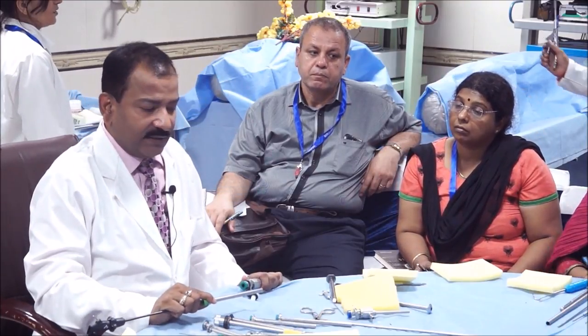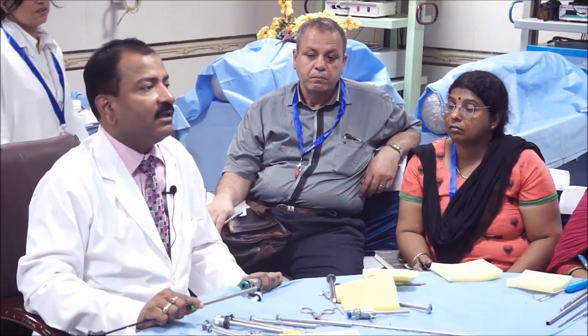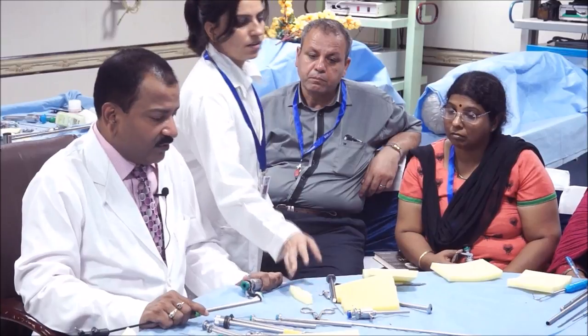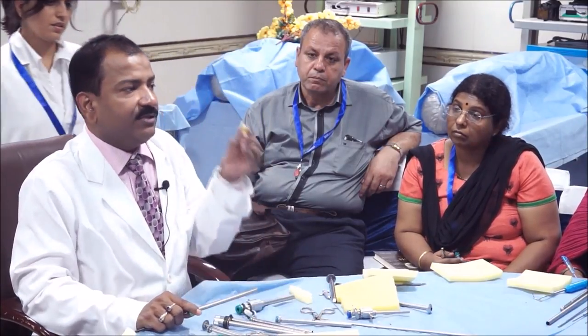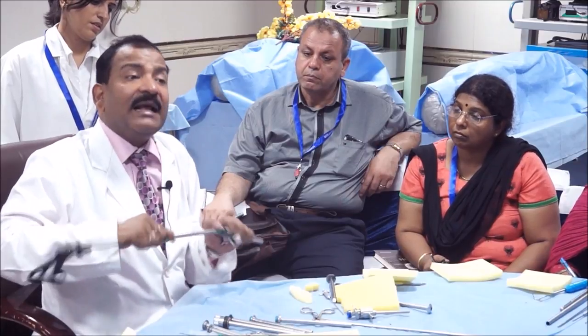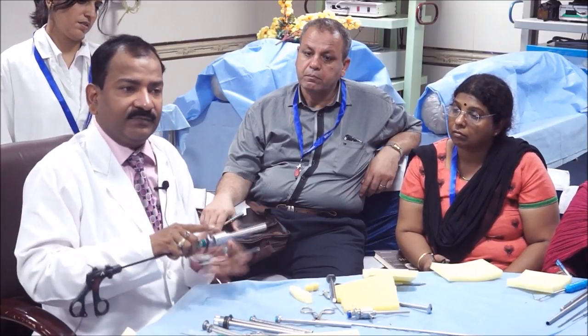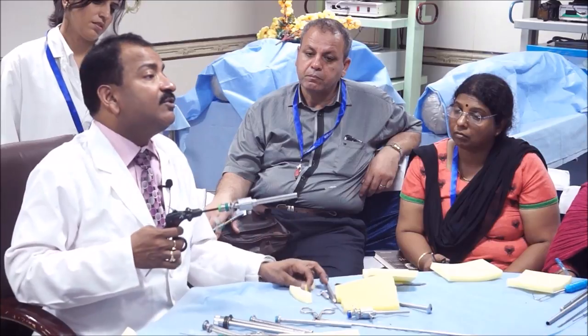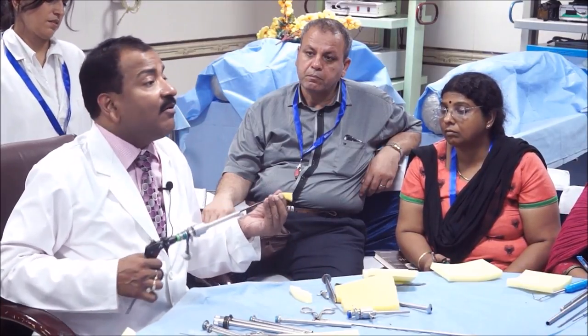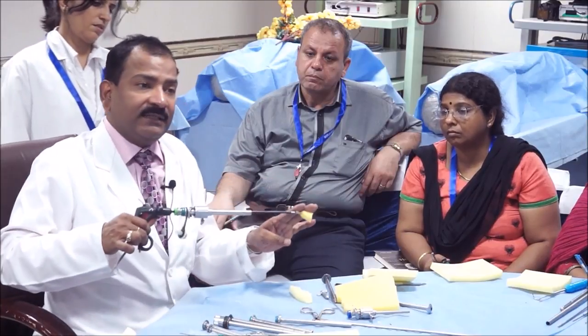Do you know why? It can be used for tissue retrieval. It can be used for knotting and suturing. Suppose you have to retrieve a small tissue out. I don't want to make the port out, and I don't want to use an endobag, then I can use the reducer, because if I take the entire port out, what will happen? The abdominal wall will be in contact.